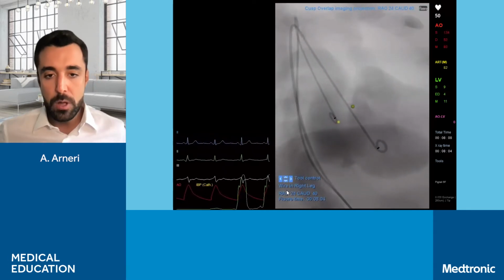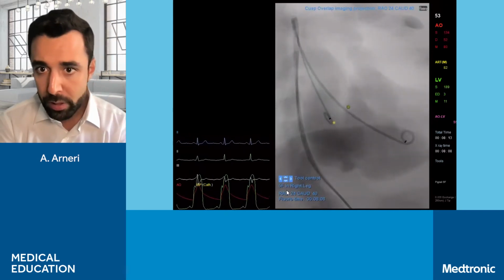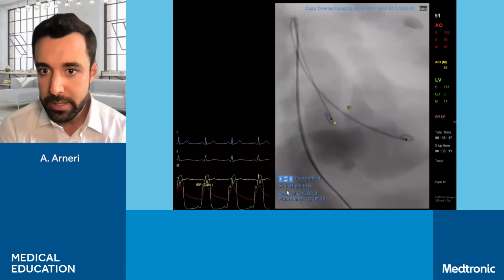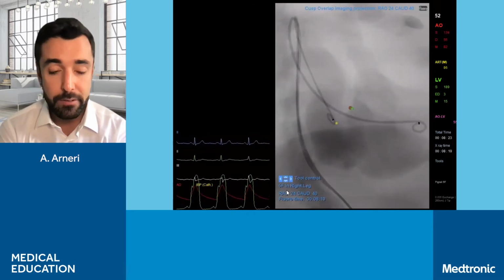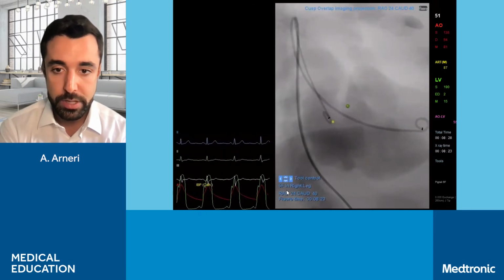We are removing now the J wire. You see now the pressure below. We have a gradient which is around 60. It's 190 compared to 136. So it's around 55. So for sure, this is a severe aortic stenosis.